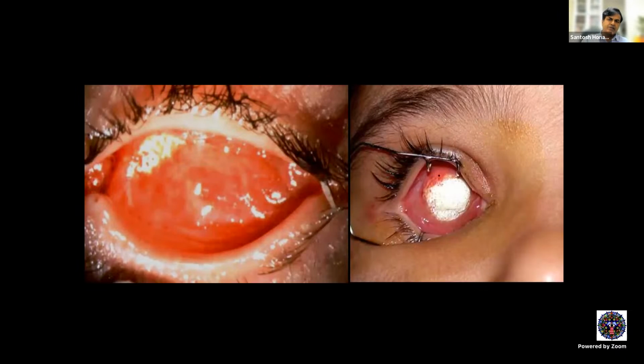These are some of the older exposures where hydroxyapatite and porous polyethylene have been used. You can see real bad exposure. Melt of the conjunctiva. This is absolutely avascular. There is a way to salvage it. You can start drilling from the anterior surface. For example, if this is the implant and this is all vascularized and this is avascular, you drill the implant until the implant starts bleeding. That means you have reached the area which is vascularized.